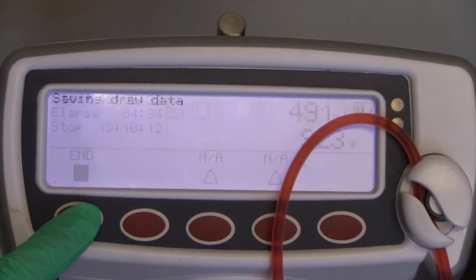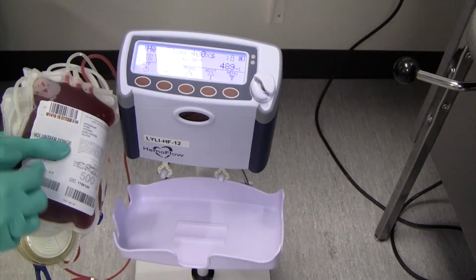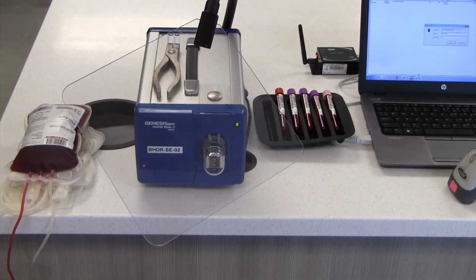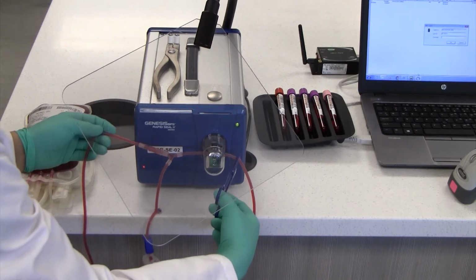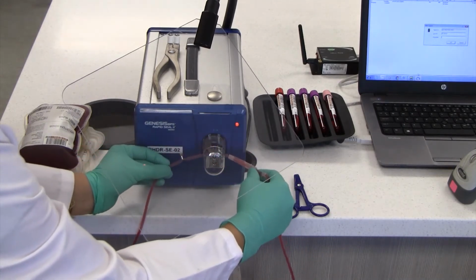Press end. Remove tubing from the clamp. Remove the bags from the bag tray. Confirm the DIN on the collection bag and tubes match the printed DIN on the donor sheet. Seal tubing adjacent to PPD between the hemostat and the Y. Release the hemostat. Seal tubing below the Y between the seal and the Y.